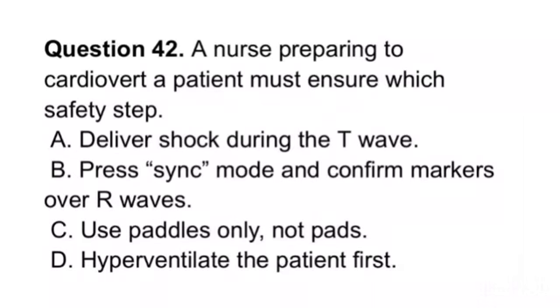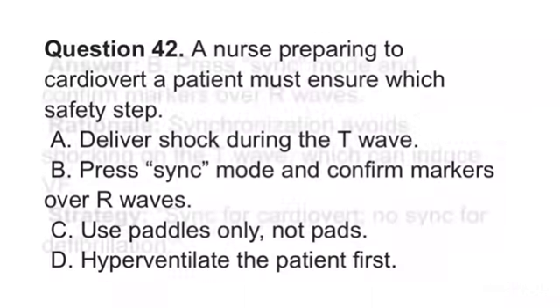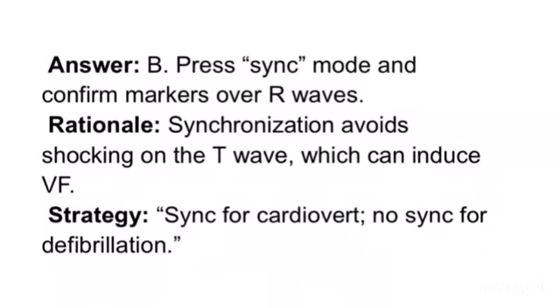D. Hyperventilate the patient first. Answer, B. Press sync mode and confirm markers over R waves. Rationale, synchronization avoids shocking on the T wave, which can induce VF. Strategy, sync for cardioversion, no sync for defibrillation.